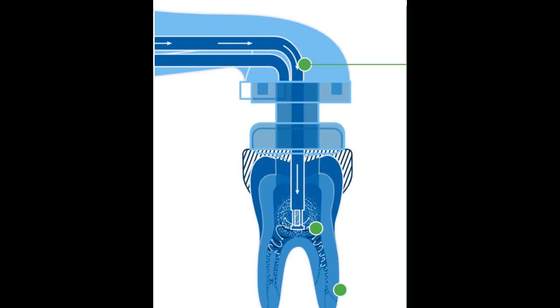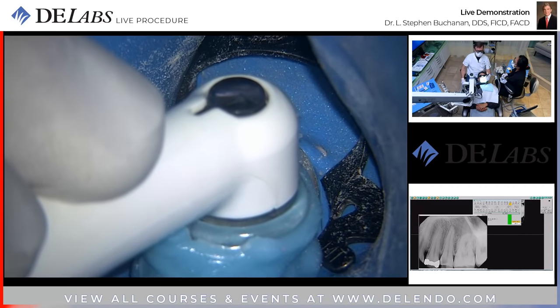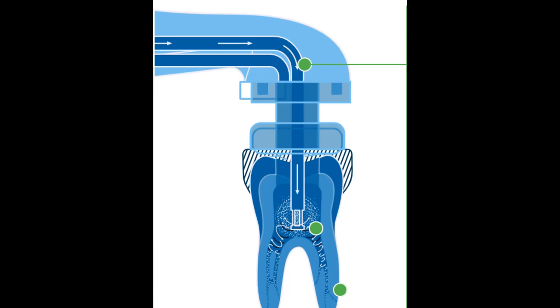You can see on the monitor, by the way, this is doing a 30-second rinse before the EDTA cycle goes through. If we can have that other image back on the monitor. This is the molar procedure instrument, and the projection with a little arrow on it, I call the tuning fork. I think that drives Mirzad wild because it's not really a tuning fork, but it vibrates, it creates the sonic energy in there, and it's also the port that the fluids shoot down at 6,000 PSI. There's a curved incidence surface on the end of that. It's closed off, and that's what shoots the solutions back up in a coronal direction. That's what creates the venturi effect.